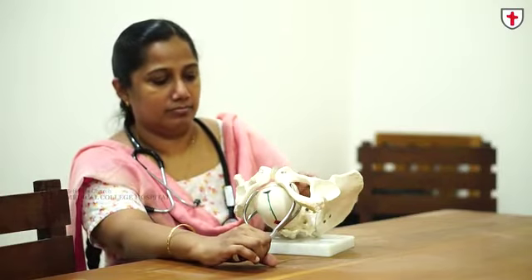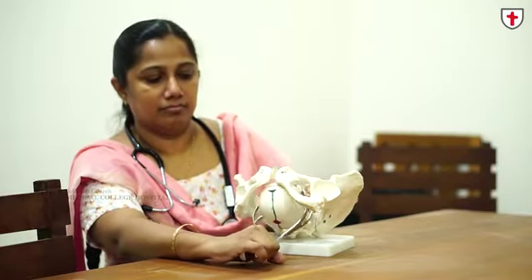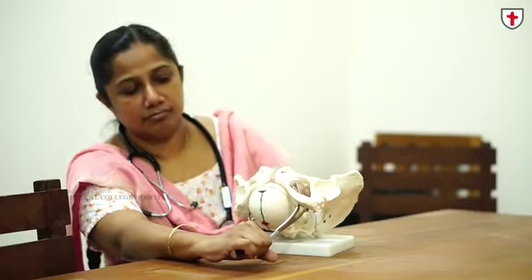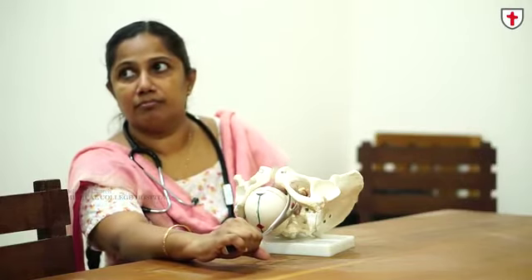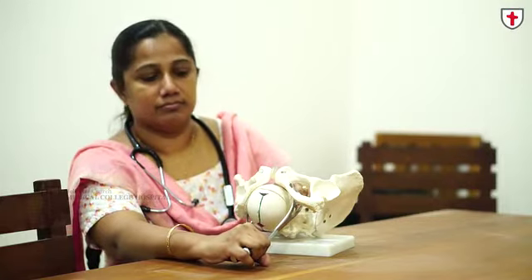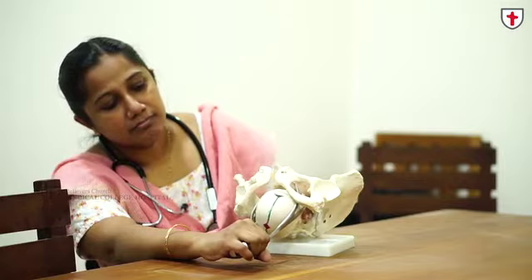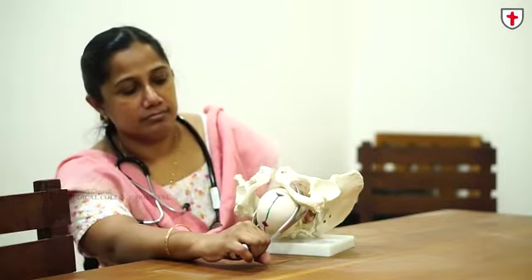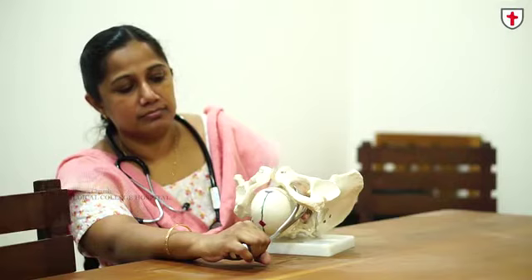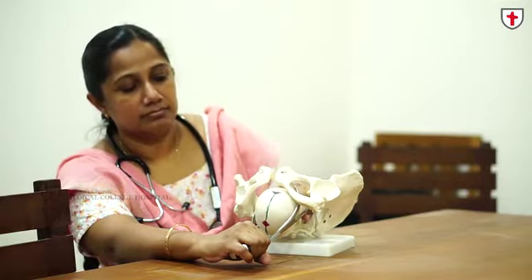The advantage of forceps is that once the instrument is applied and locked, it takes no time because you don't wait for maternal forces to act in bringing out the baby. In fetal distress, heart disease, and similar situations where you don't want maternal effort and need a very quick delivery, this is the ideal instrument. It can be applied in vertex presentation that is either fully rotated or near-fully rotated — within 45 degrees — by doing a digital or manual rotation as described in the occiput posterior presentation video.